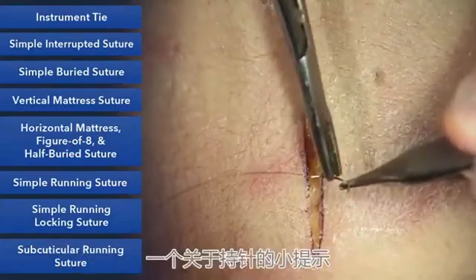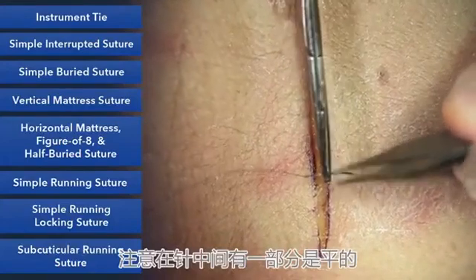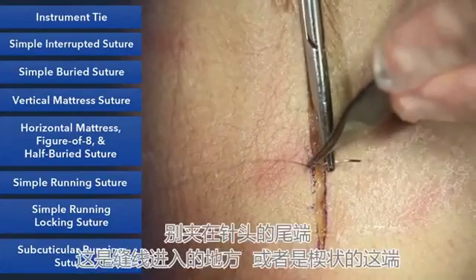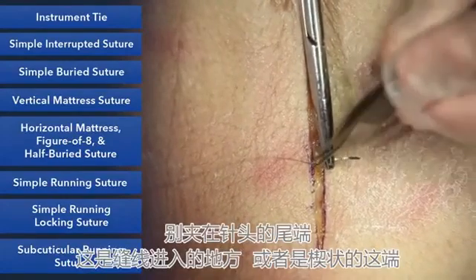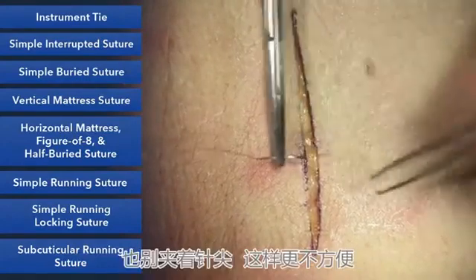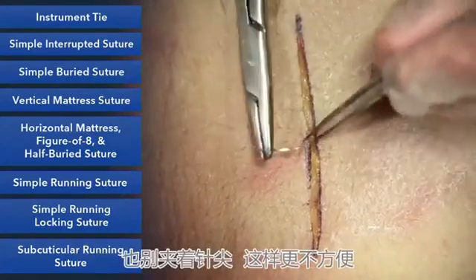Just a quick tip on handling the needle. You'll notice your needle has a flat portion in the middle. This is where you grab the needle with your needle driver. You don't want to grab it at the end where the suture comes in or the swedge, because it's round and you'll be unstable. Never grab the needle at the tip because you'll dull it.